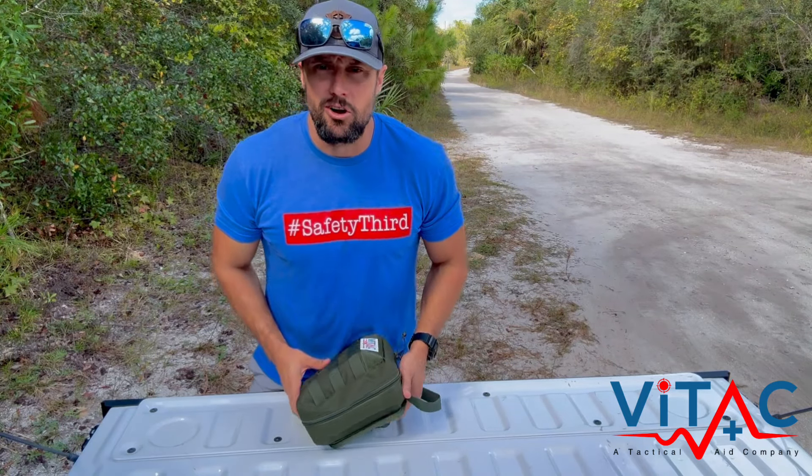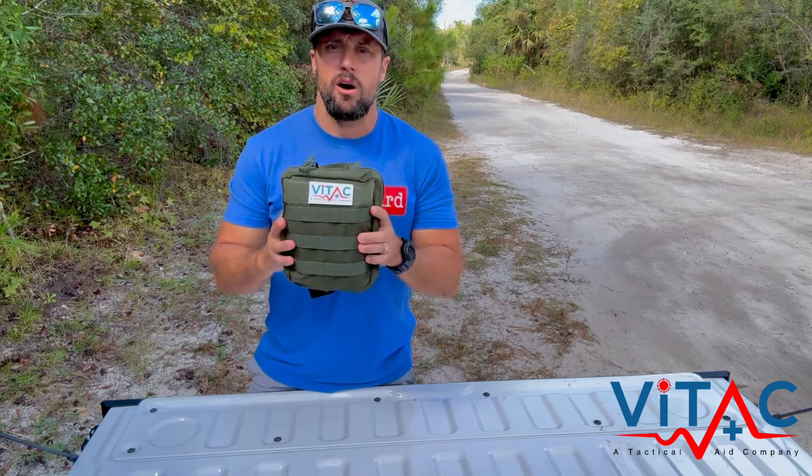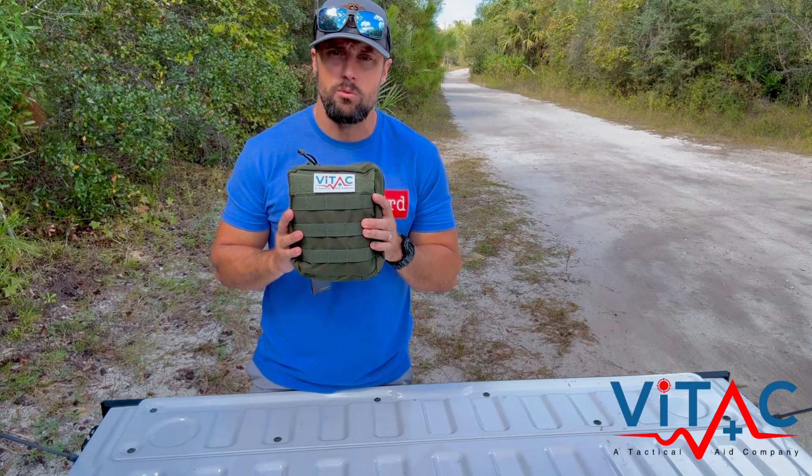Hey, what's up everybody? Sterling again with Vitec. We appreciate you guys. This is going to be your run through of the Adventure First Aid Kit. AFAC is what we like to call it.